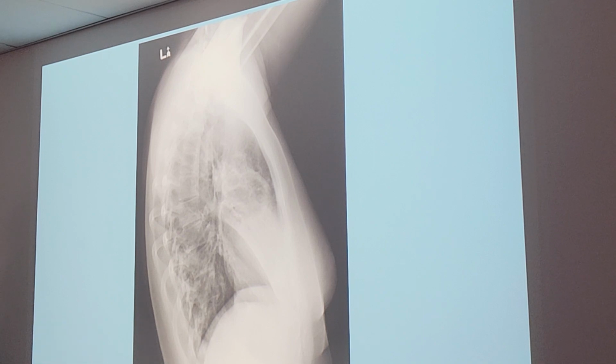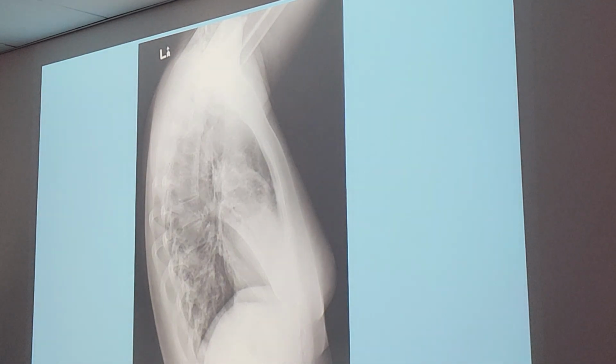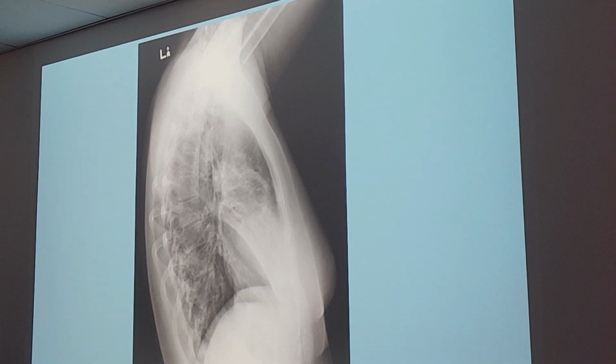What is always coming in the front, ma'am? It's the breast, and then on top of the breast tissue. Is this breast tissue also the white on top of the breast? Yes, I'm assuming it's breast tissue because I don't see anything else that tells me it's something else. Should you be able to see the arm? If the collimation is longer than 17 inches, you will see the arms, which tells me it was left open. It doesn't go over 17, right?